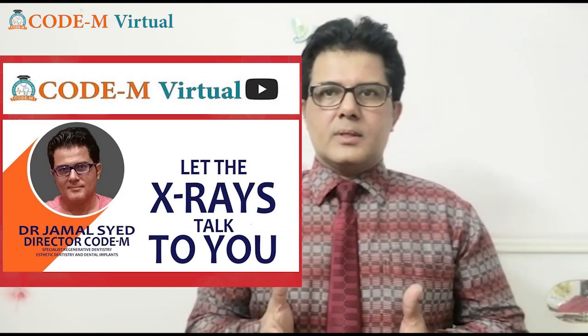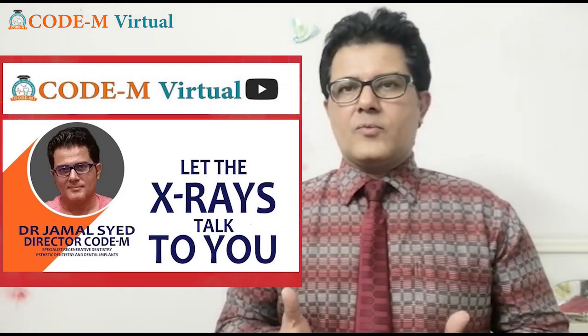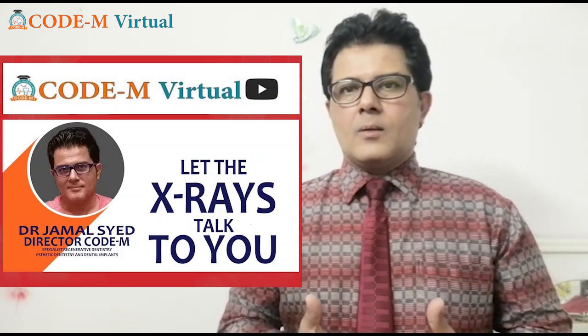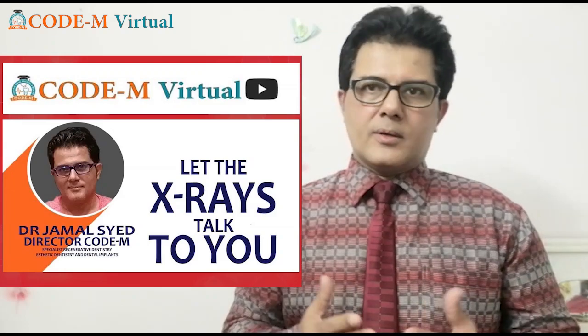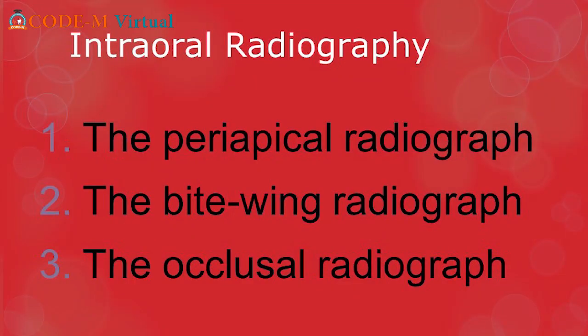Today we will talk about the three types of intraoral radiographs, but in detail we will be talking about the periapical radiography. The intraoral radiography is of three types: the periapical radiographs, the bitewing radiographs, and the occlusal radiographs.